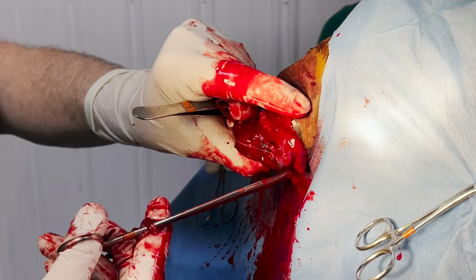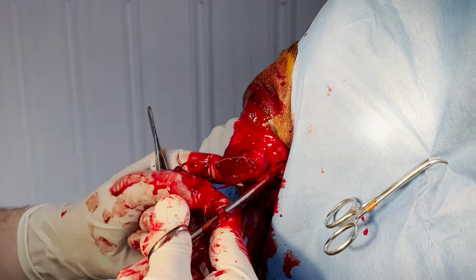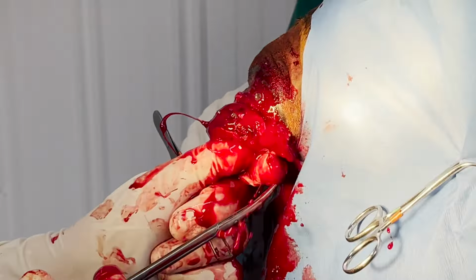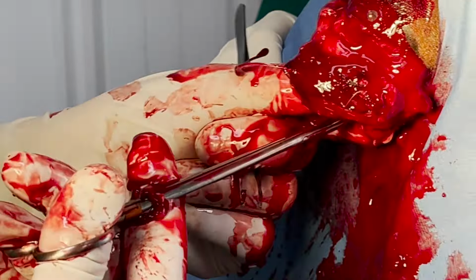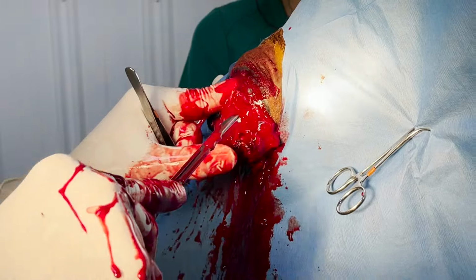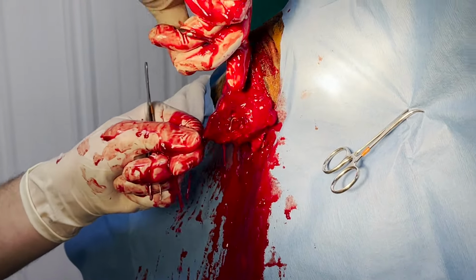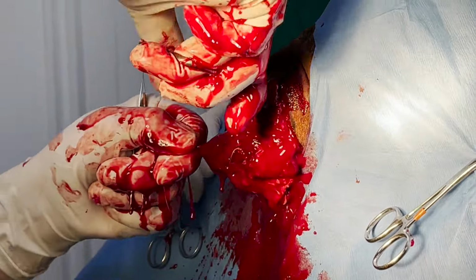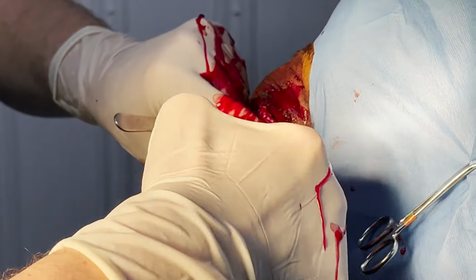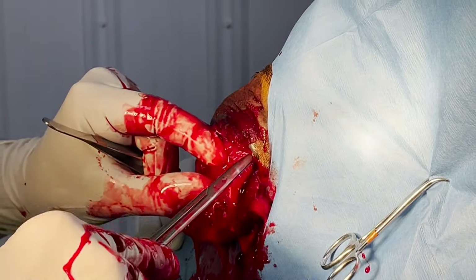If you don't pull on it, they do better, but it's kind of hard not to. The other thing I'm trying to do is not pull that out very hard, because if you pull on it, that's stretching that nerve, even though it's blocked, sometimes they'll react a little bit. But our block worked very well for this. There's been a few we've had to go in at this point and infiltrate with more block, but our block worked good the first time on her. So once you see all that hemorrhage, you know you're close to getting the eye out of there.